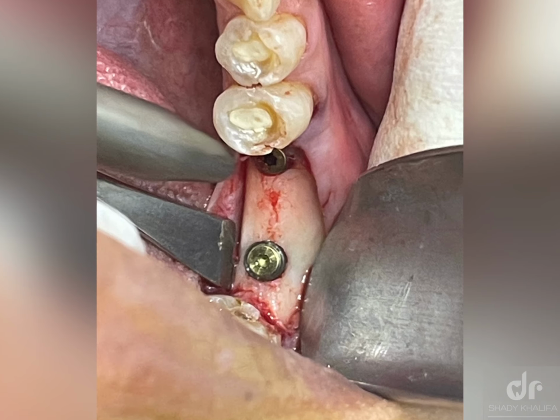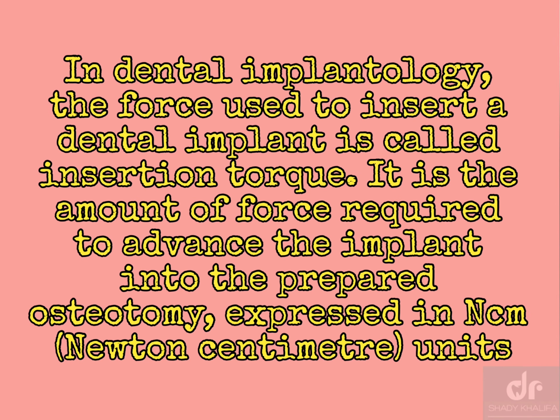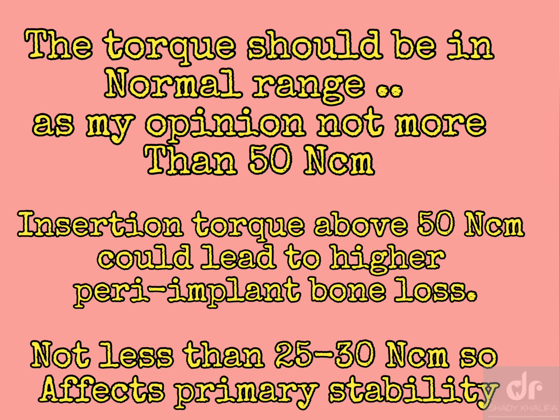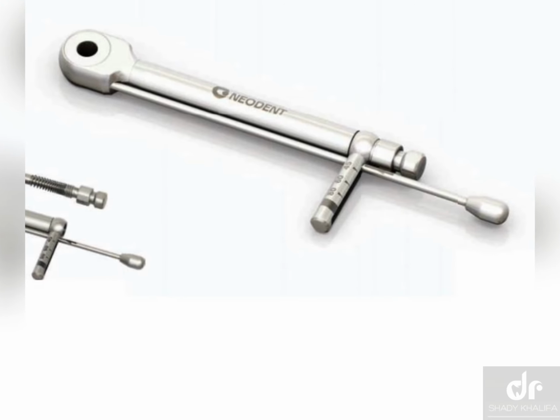I want to mention something regarding the torque. The torque, if we want to define it, is how much force is acting on the implant that causes the implant to rotate. It is expressed in Newton centimeters, Ncm.